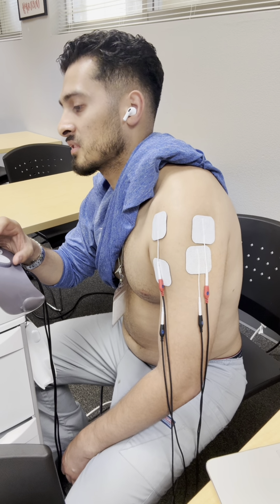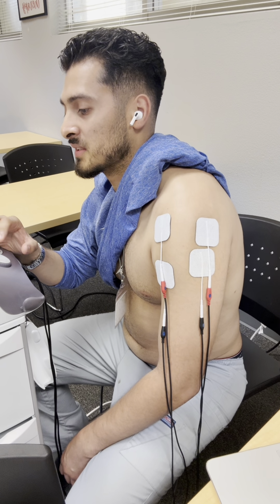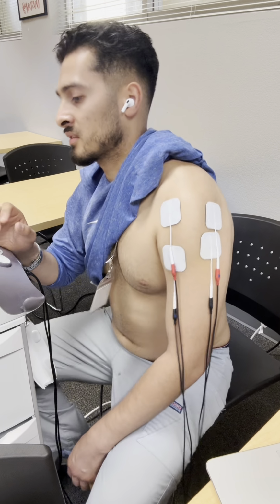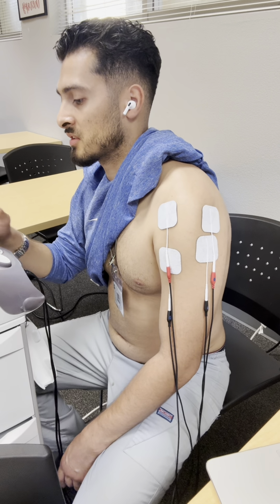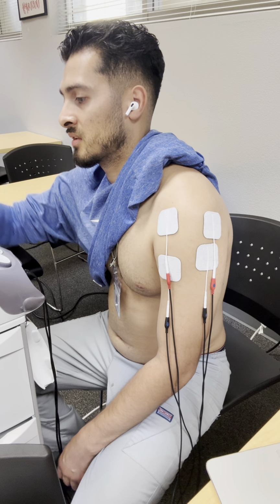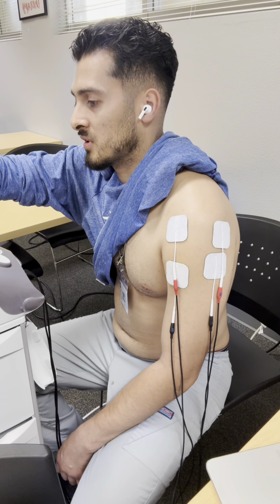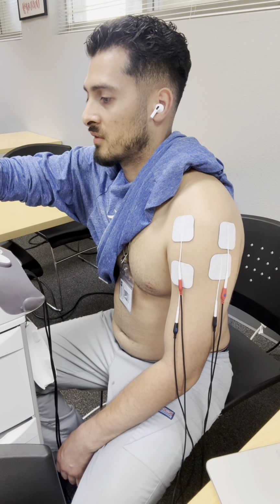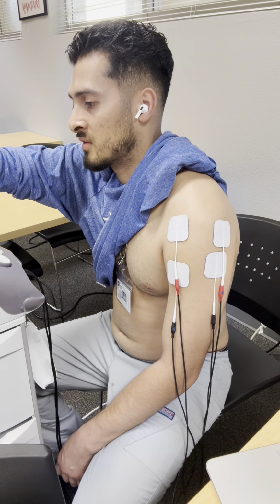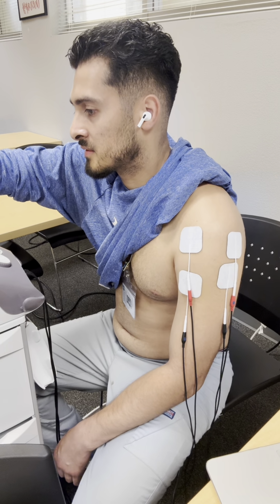Ooh, 10.5 right there. You can feel that buzzing intensify. So we're going to make some adjustments here. Pause. So we're going to take the beats down to the lower levels to try to get that opioid release. So I got the low beat set at 2, and then the high beat is going to be set to 10.